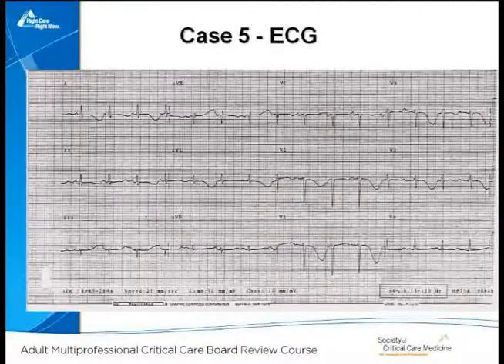And we can start the clock. Dr. Perillo always tells me people get the electrolyte imbalances all the time, and most of the people got it.